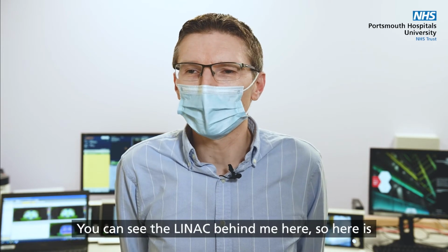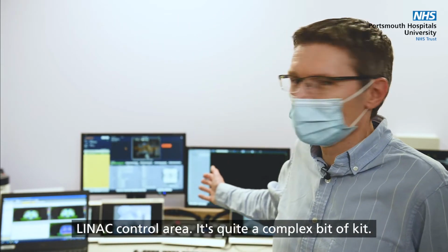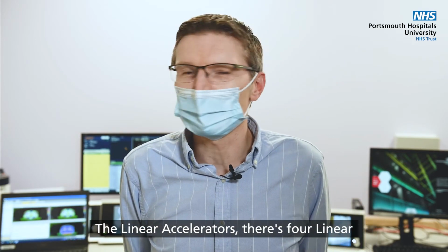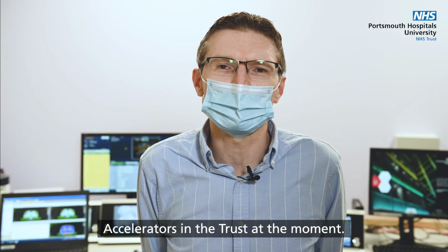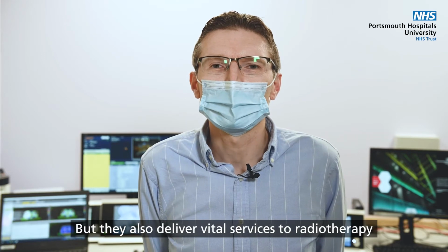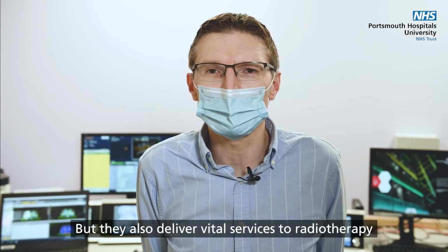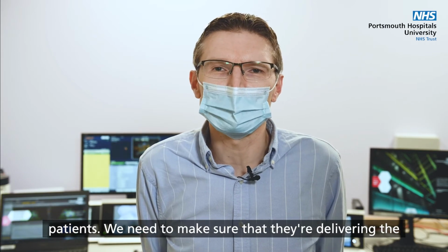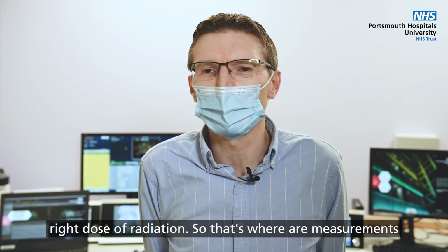You can see the LINAC behind me here. So here's the LINAC control area. It's quite a complex bit of kit. There's four LINAC accelerators in the trust at the moment. Very complex equipment, very costly, but they also deliver a vital service to radiotherapy patients. We need to make sure that they're delivering the right dose of radiation, so that's where our measurements will come in.